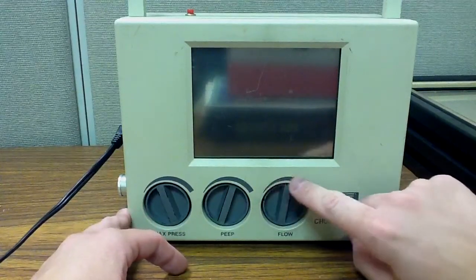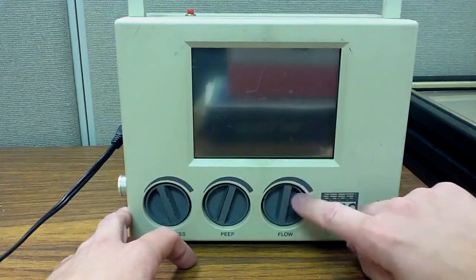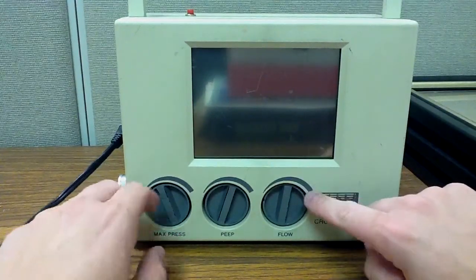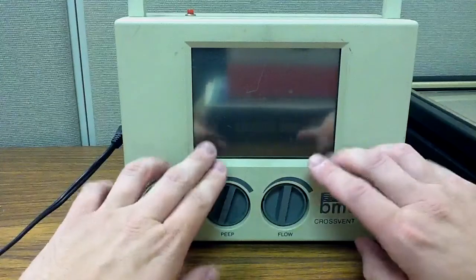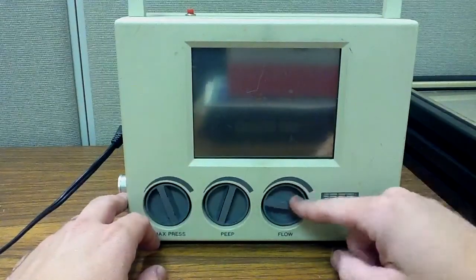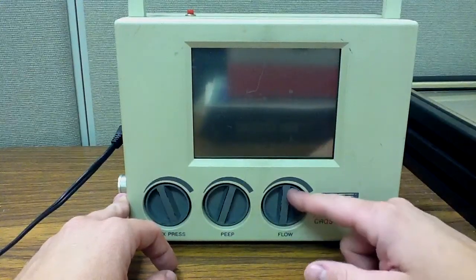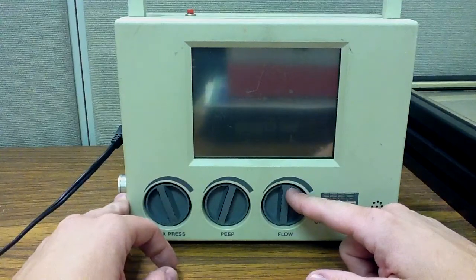And then this here is very important. This will be really important when we talk about I:E ratios and I time, because this is actually how you'll set all that. You will not actually set an I time in volume control ventilation like you would the LTV-1200. If I increase the flow of gas into the patient, that will decrease my I time and increase my I:E ratio.